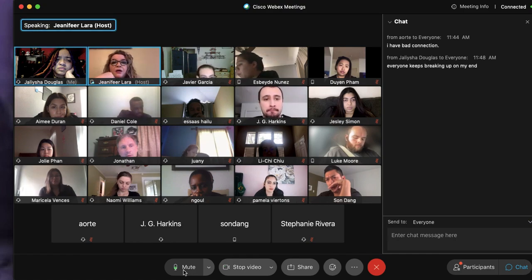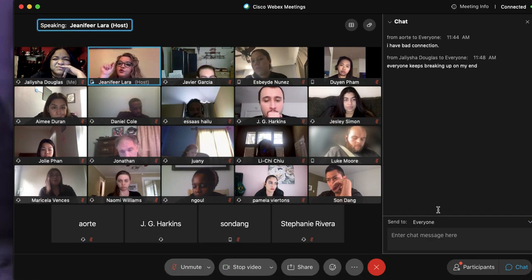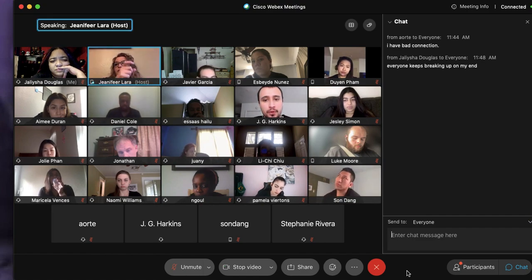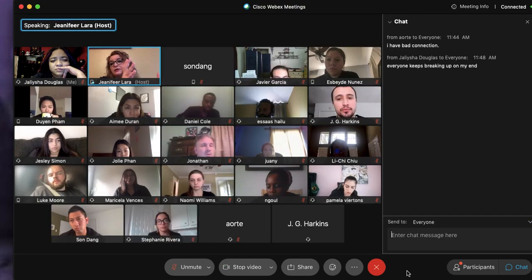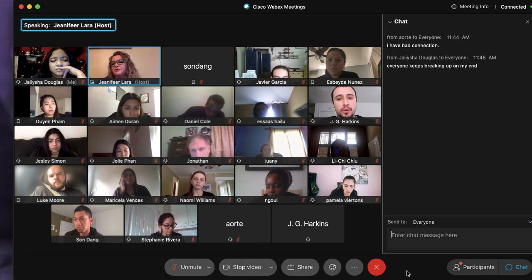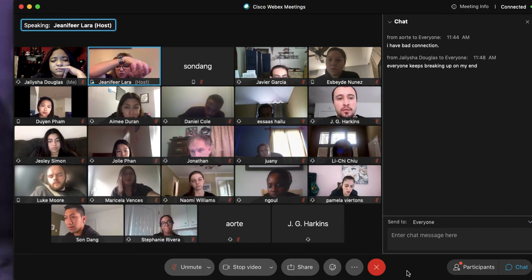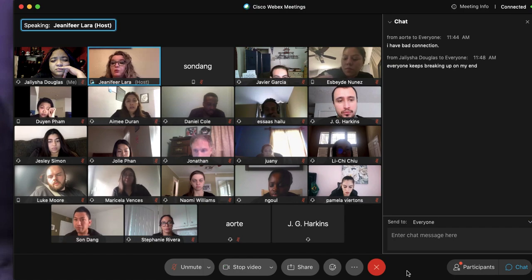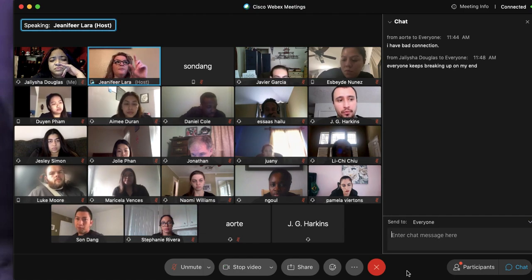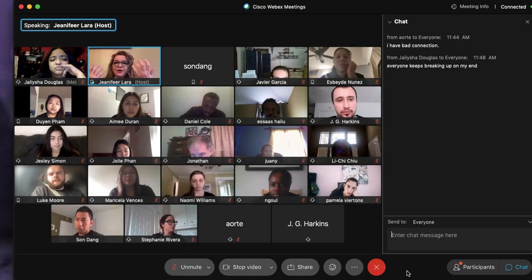It is called a CR reader, for computed radiography reader. It is going to transfer the stored photon energy from the screen inside of the CR image receptor, or CR cassette or imaging plate, whatever you choose to call it, into the monitor. In direct radiography, we don't have that piece of equipment. We don't need it. That is one less step from taking the image and manifesting the image. Make sense?